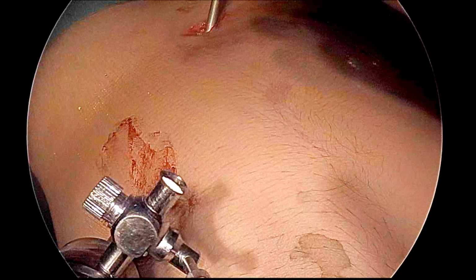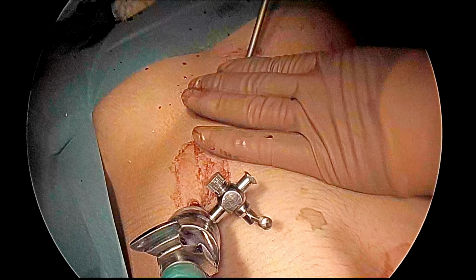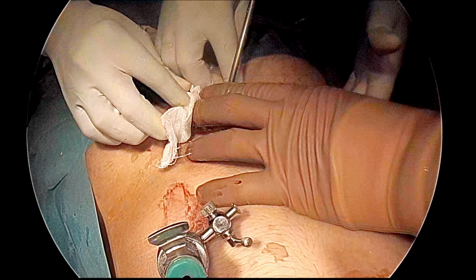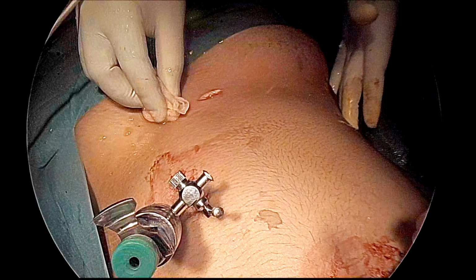So now the gallbladder is out. After that, you should clean this epigastric port with irrigation, so that any bile or any other tissue or fragmented stone should not be there. It should be nicely cleaned, because that can sometimes create infection. So it should be nicely cleaned, and this is over.